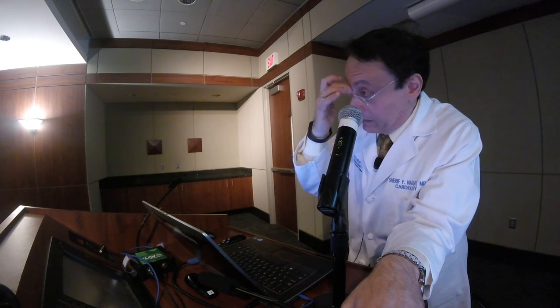Same thing with regurgitant lesions, right? You don't mention anything here about the TR jet and PA pressure, which are important. We had them in earlier slides. So if they are low, you've got to be careful. There's no high filling pressure in somebody who has a PA systolic pressure of 20-25, right? It's not going to happen. So you need some consistency internally.